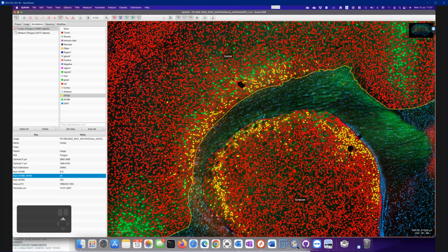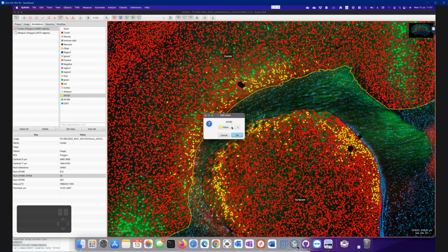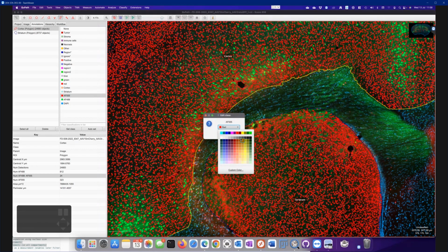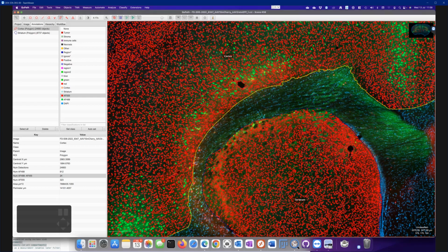I shouldn't have probably used the yellow as a classifier color for the classifier. I can change this back to red here. Yeah, maybe it's not a good idea. Let's choose something else. Purple? Magenta. Let's use magenta. So you see magenta here, green here. I don't know where the double classified, but the color of those double classified should be specific.